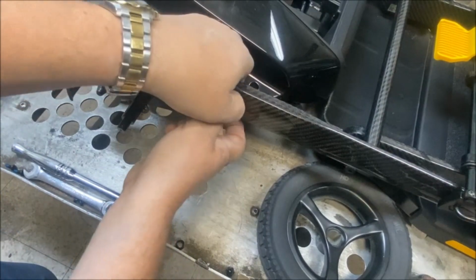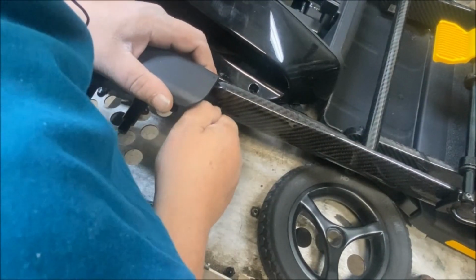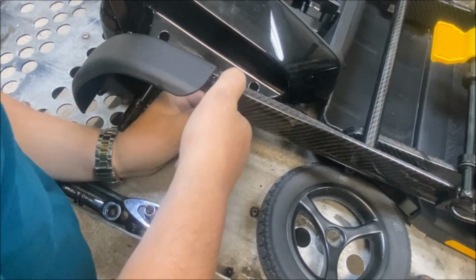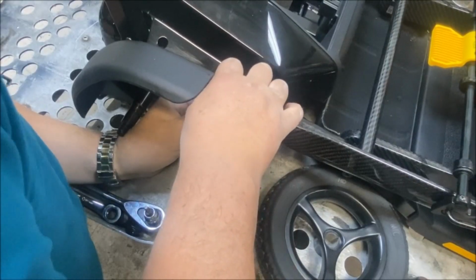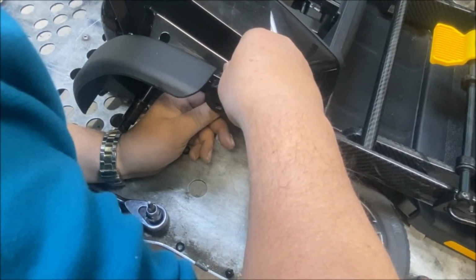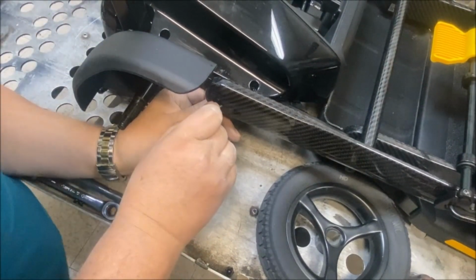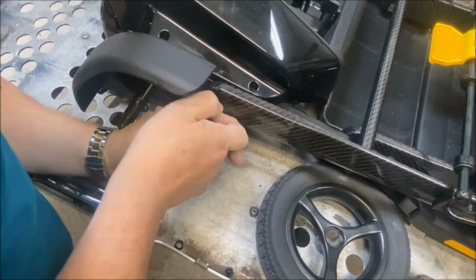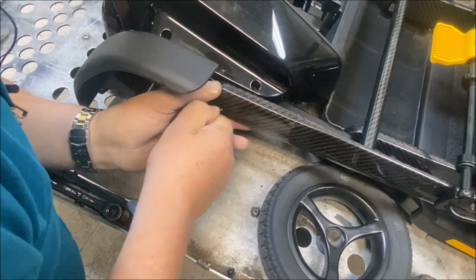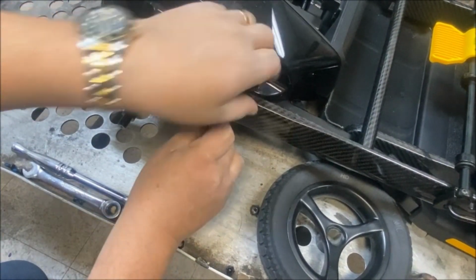Now these inserts want to fly away, just want to fly. They want to come out of the frame. They're held in by hopes and dreams. Alright. You just got to kind of finesse them. There we go.